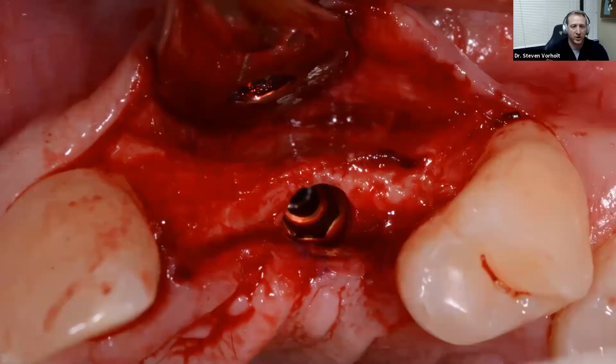So here's a better shot all the way down the buccal plate. We can see no implant threads, no show through of the implant. This implant is placed fairly deep. You can notice it's probably about 1.5 millimeters below the plate, where the bone does get a little bit thicker, which was the plan. And you can even appreciate here, it would have been very difficult to place an implant in the number 10 site and be maintaining those ideal dimensions for implant to implant spacing.